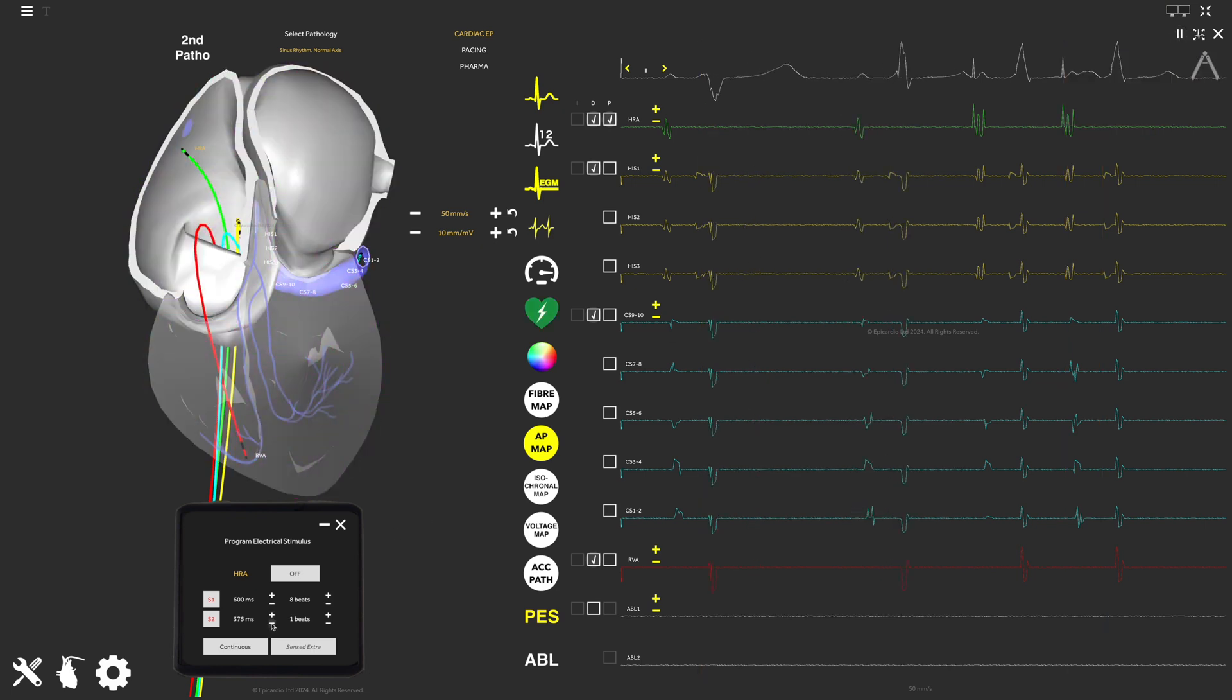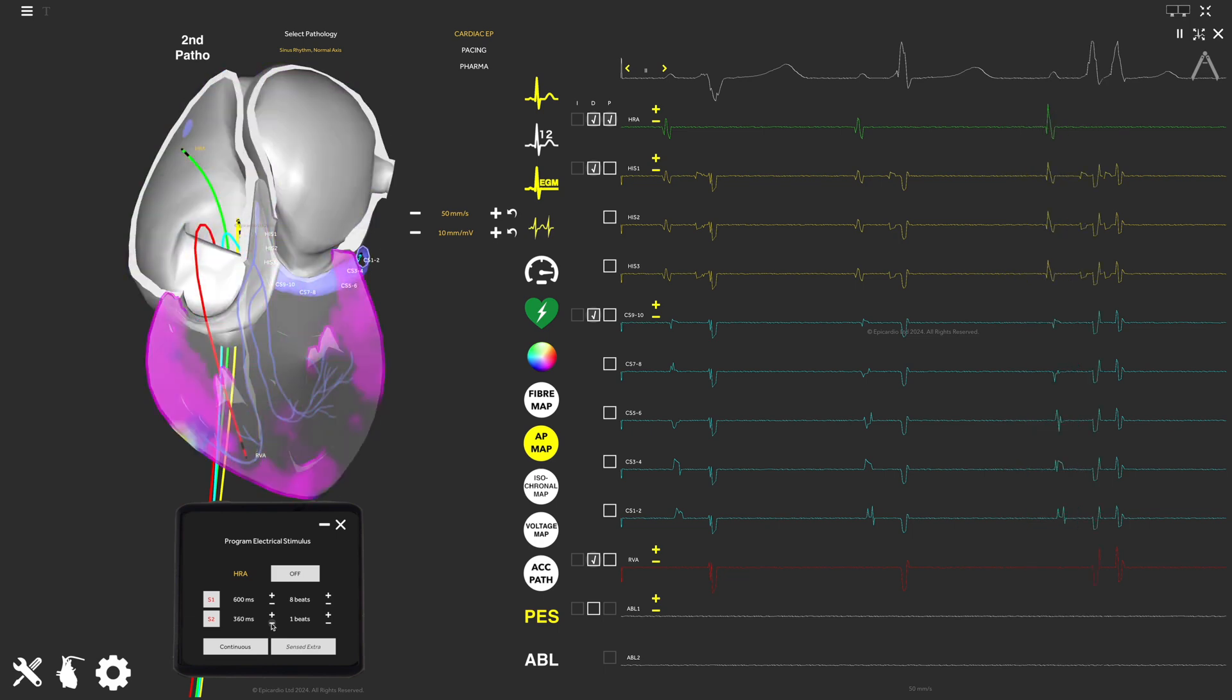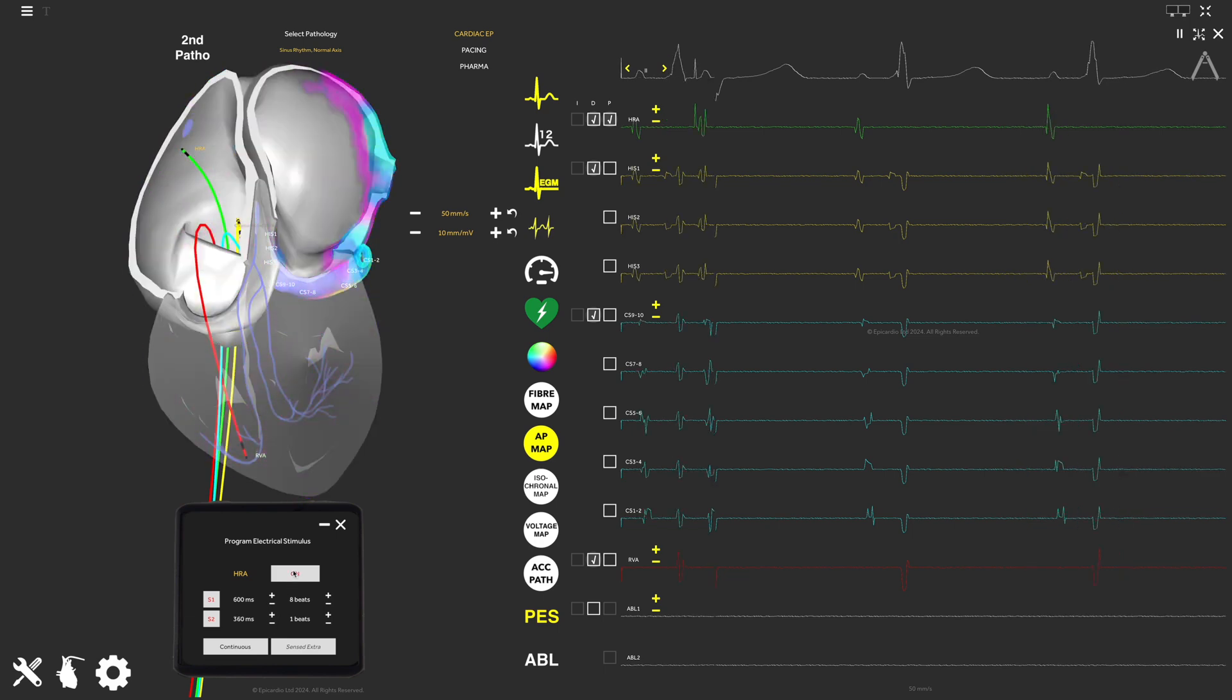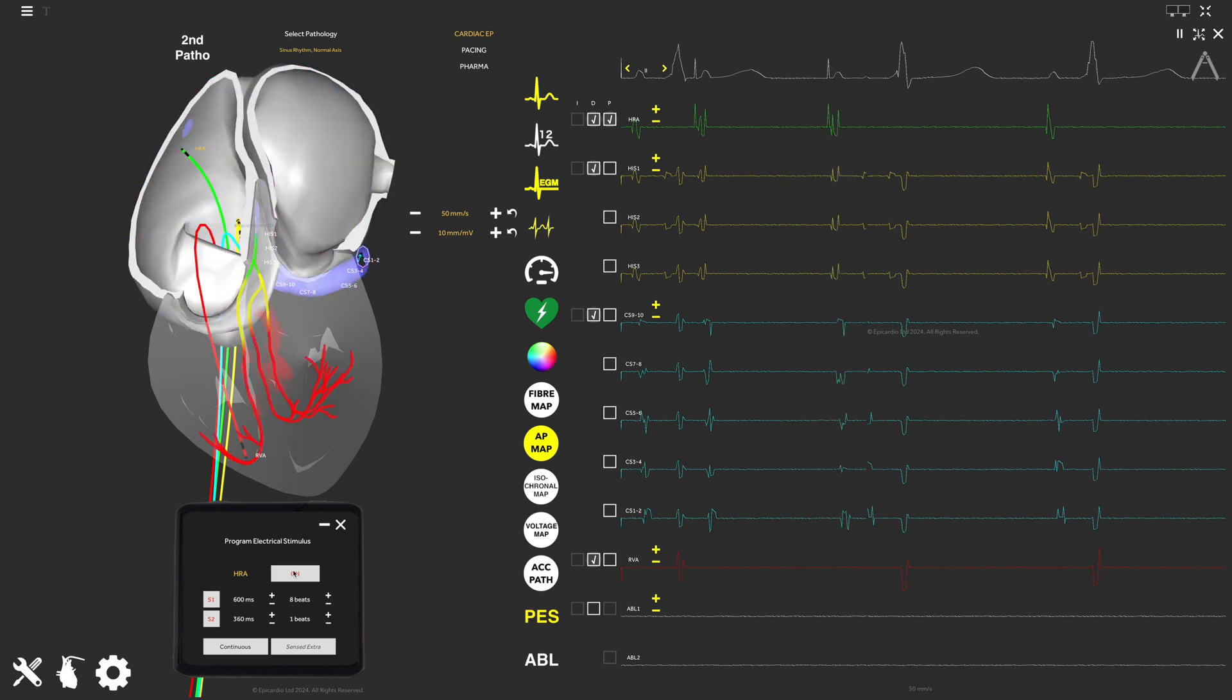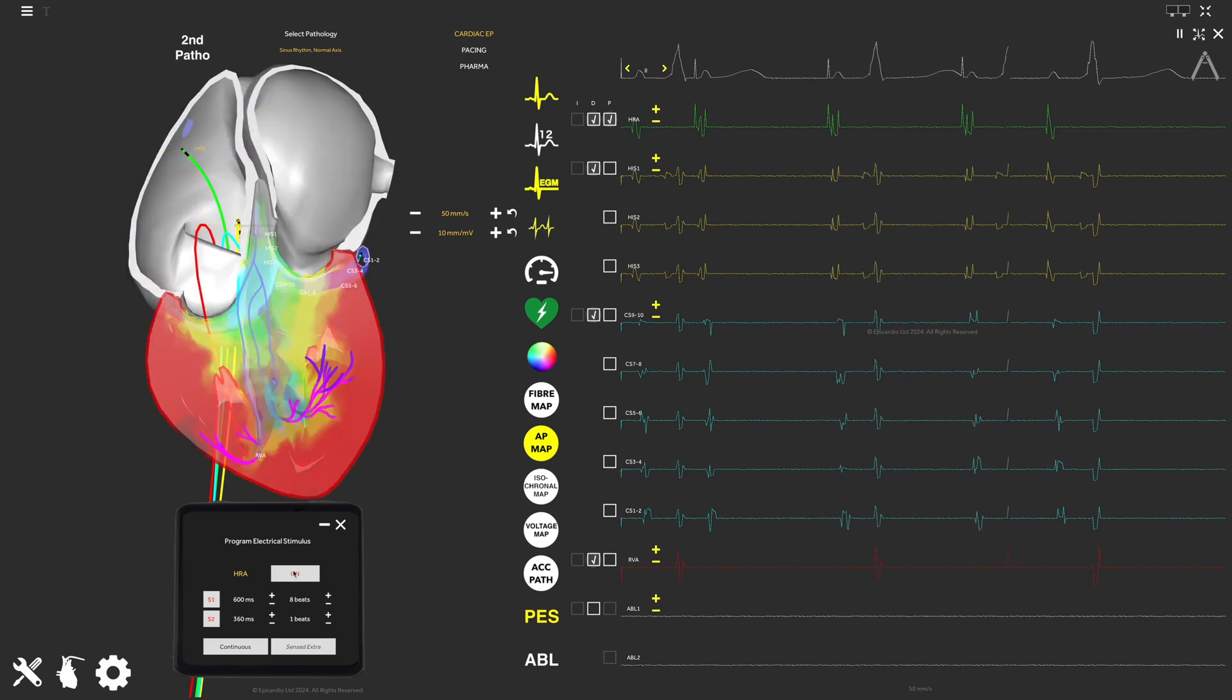You can continue exploring the rest of the Epicardio simulation tools by following the user guide and the AVRT tutorial, available on PDF from the help menu inside the Epicardio application.